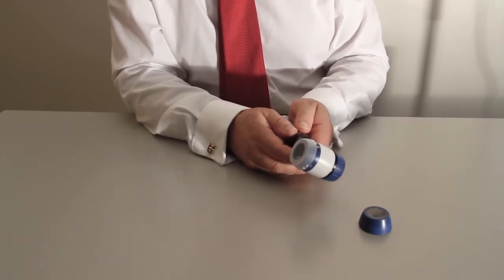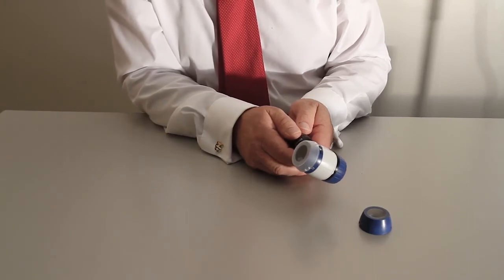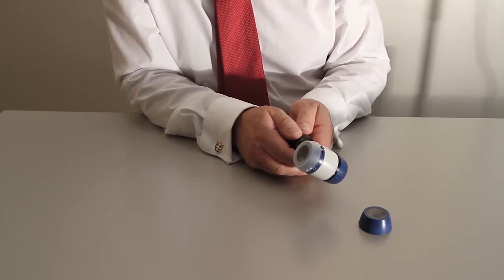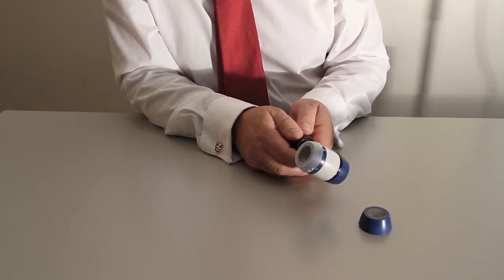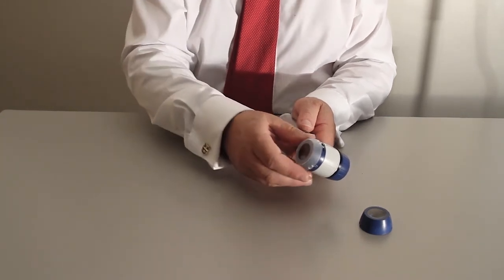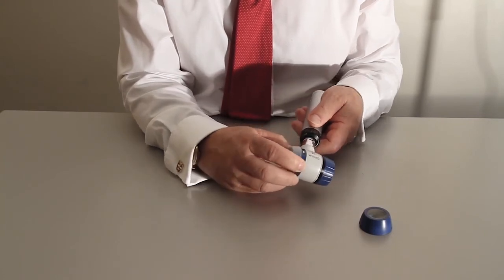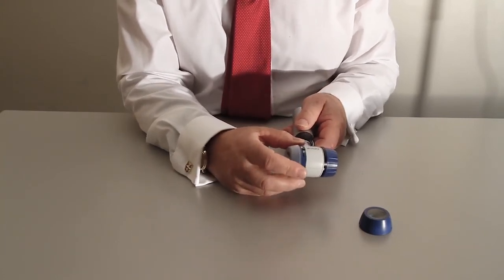That's really good for looking into difficult areas where you don't want to contaminate your dermatoscope, for example the genitals, or if you've got a particularly nasty weeping lesion or a crusty lesion that you'd rather not have contact with. It can have both the polarizing mode and the non-polarizing modes as the normal lens.